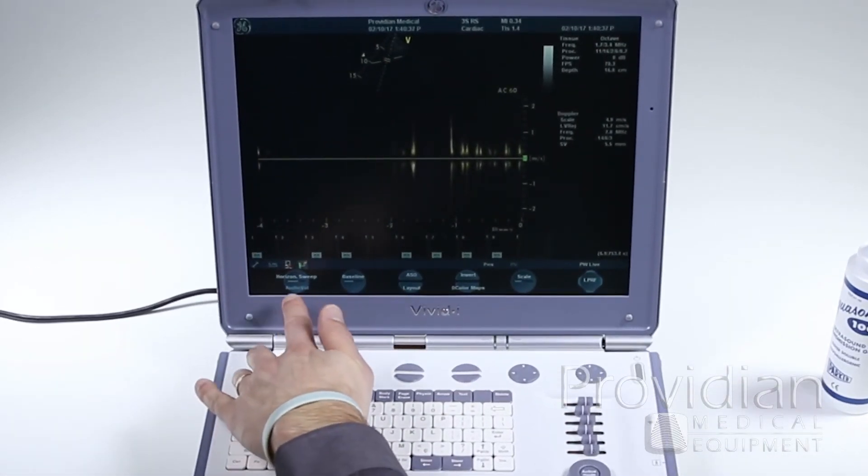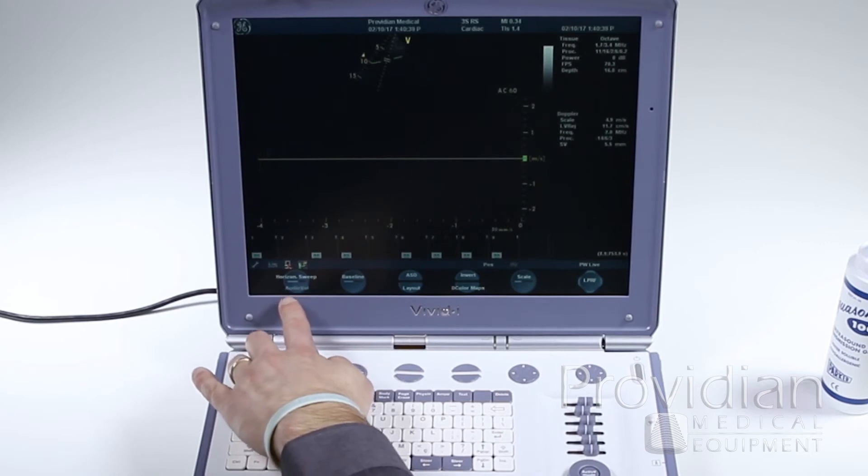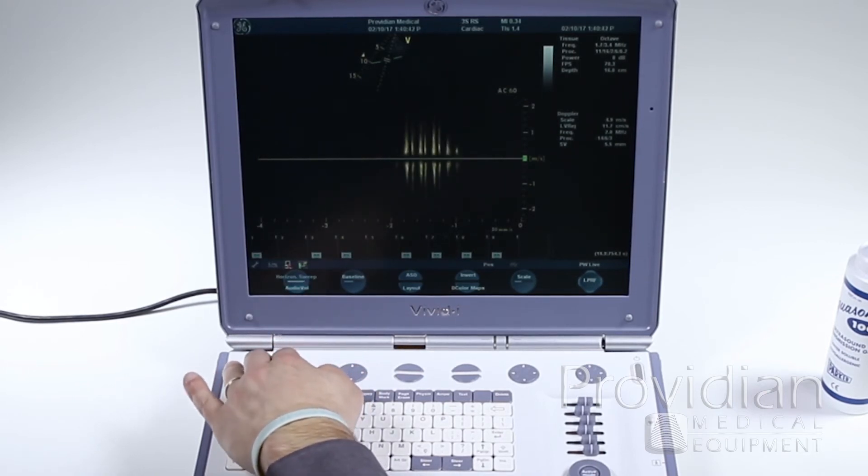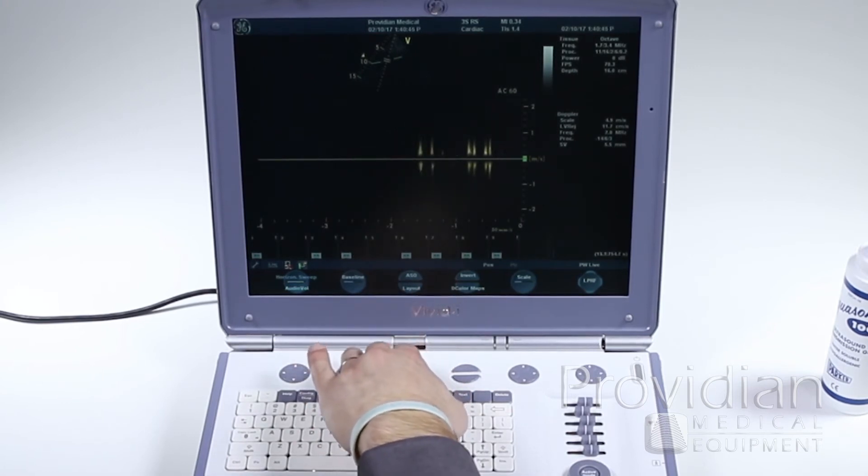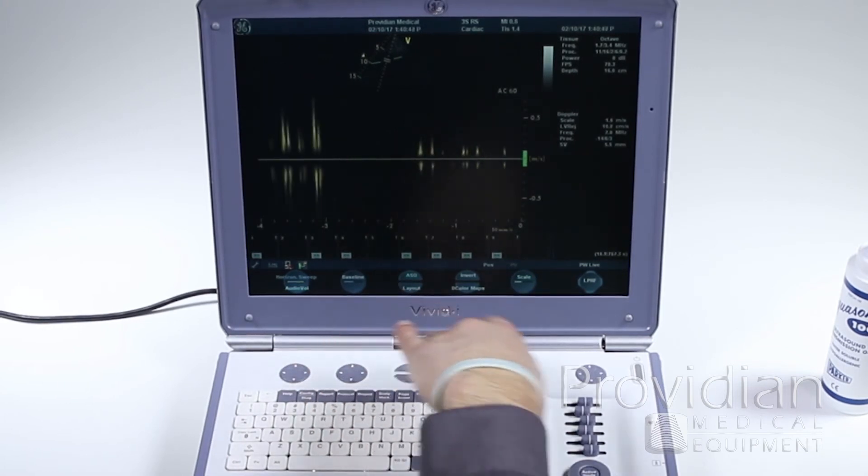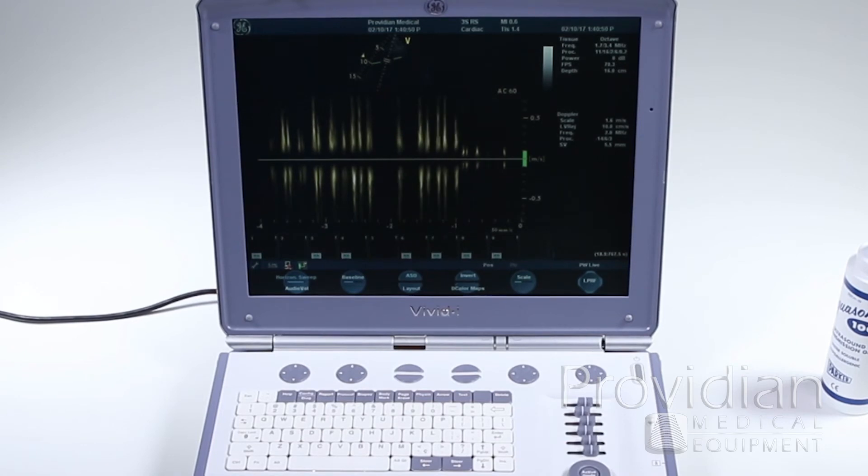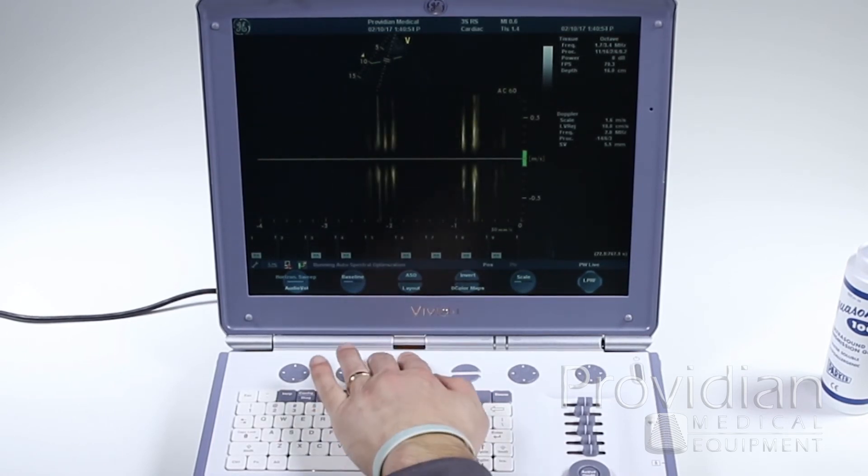Again, you have multiple functions down here for the sweep speed, the volume of your Doppler, change your baseline. ASO is auto spectrum optimization, so if I click on that, it's going to try and adjust the scale and everything to what it thinks I am looking at each time I press that.